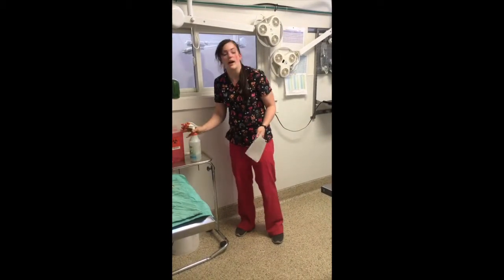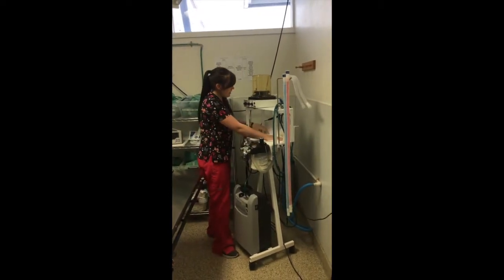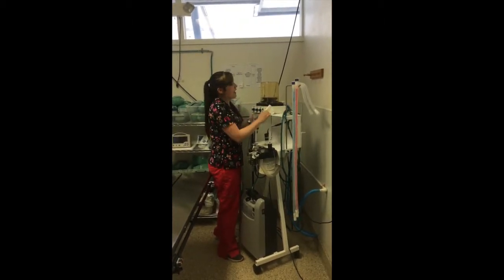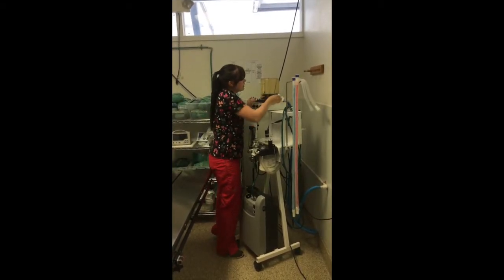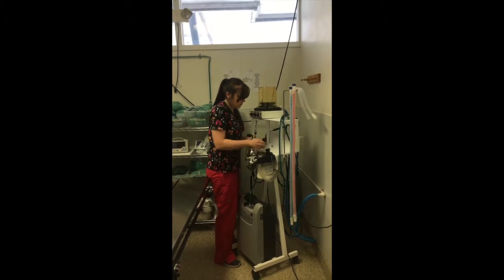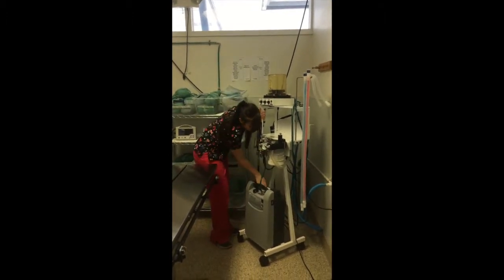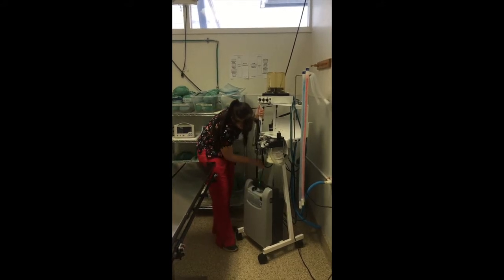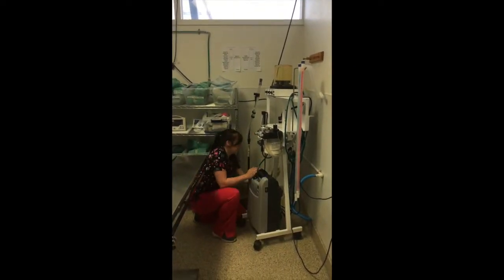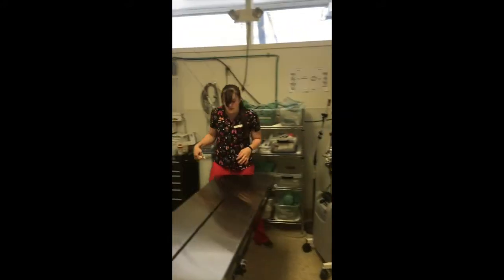Another paper towel, spray that down, and we're going to come over to our anesthetic machine, and we're just going to gently wipe down all the surfaces of this machine. So I'm just gently wiping down every little bit. Again, with our Cedar, top of the ventilator, each side of the ventilator, oxygen generator, up the lines, down the legs, each side. All right. So that's all wiped down.